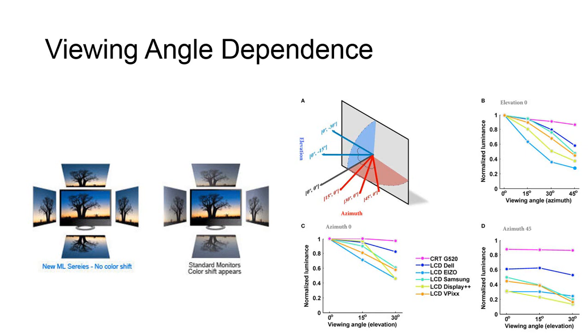The stability of a self-calibrating LCD should be checked by measuring the stabilized brightness every day for the first week, once a week for 1 month, and then each month for 3 months using a photometer. Luminance testing should occur on all LCDs annually.